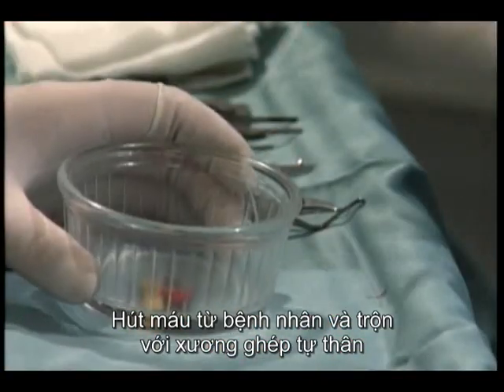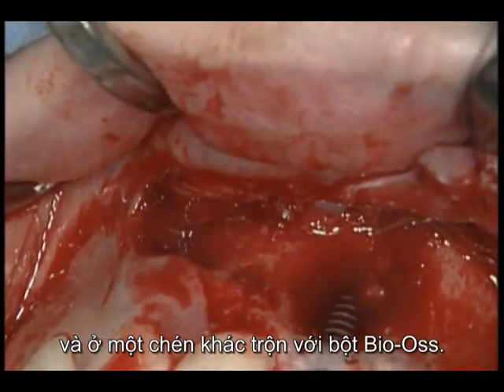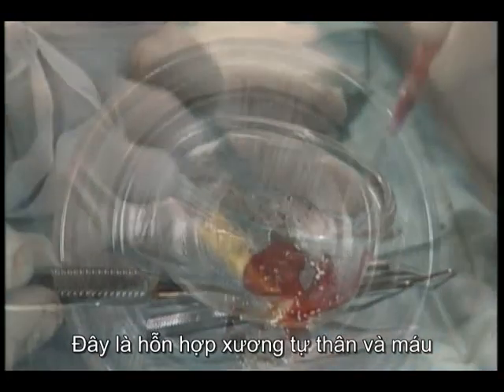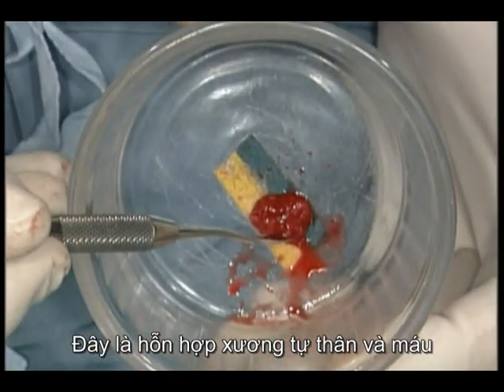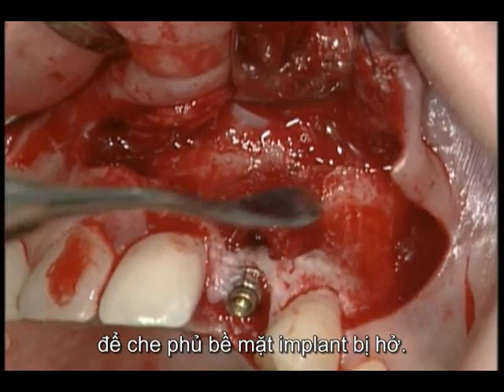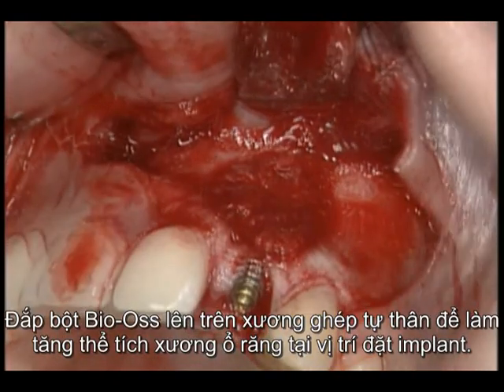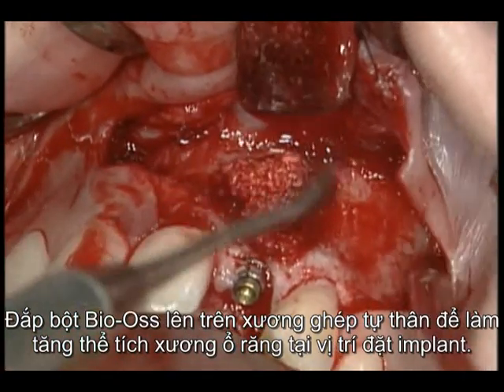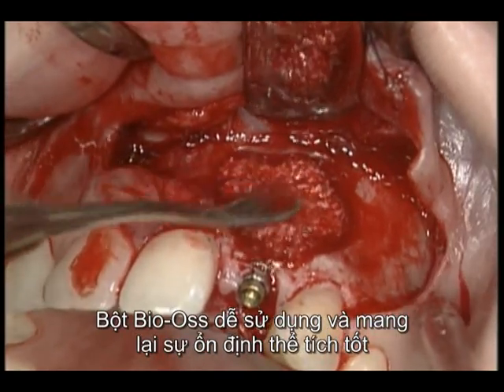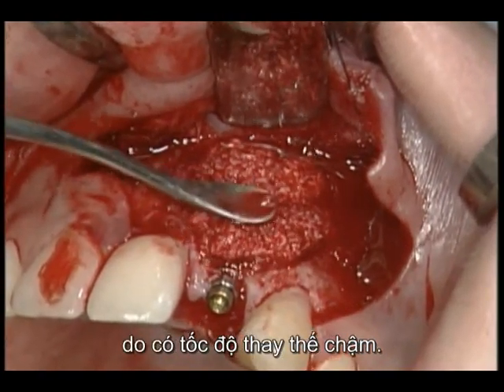Blood is aspirated from the patient and mixed with the autogenous grafts, and in a separate dish with Bio-Oss granules. The mixture of the autogenous bone and blood is shown here. It will be directly filled into the fenestration defect to cover the exposed implant surface. The autografts are covered with Bio-Oss granules to over-augment the alveolar process in the implant site. Bio-Oss granules are easy to apply and offer good volume stability due to the low substitution rate of Bio-Oss.